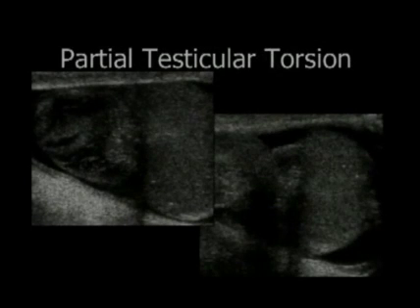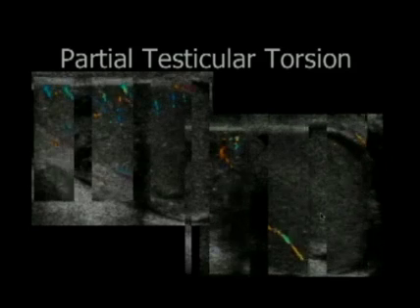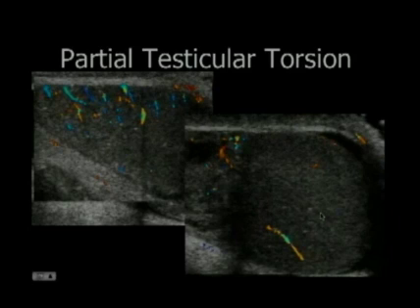So this child came in with acute scrotal pain, has an abnormal lie of the testis, okay, has this paratesticular mass, even has some microlithiasis just for a bonus, has some surrounding hydrocele fluid, but if you turn on color Doppler, normal side has lots of flow, but this side also has arterial flow, and if you are in a practice where you just trust on that as a sole sign, you're going to miss this case.